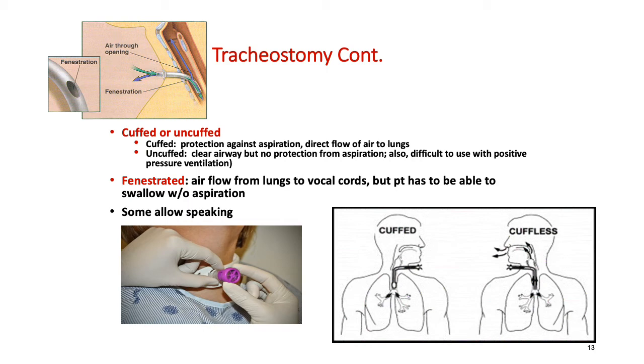If they have a speaking valve in place, it's not recommended that patients put their fingers over an open tracheostomy tube. I've seen people do this, but of course there can be bacteria on the fingers.